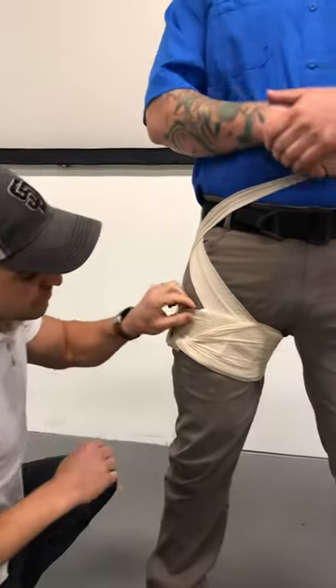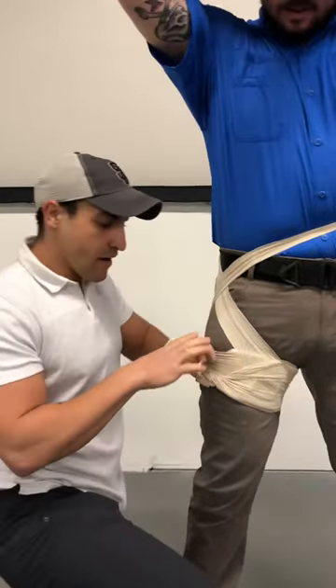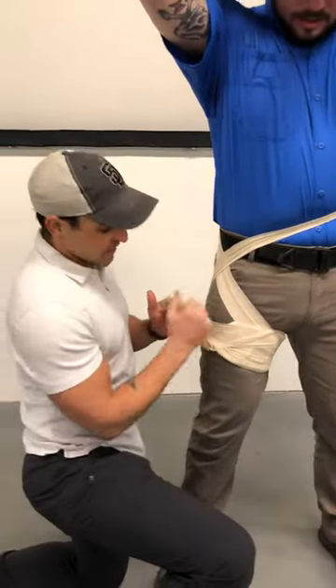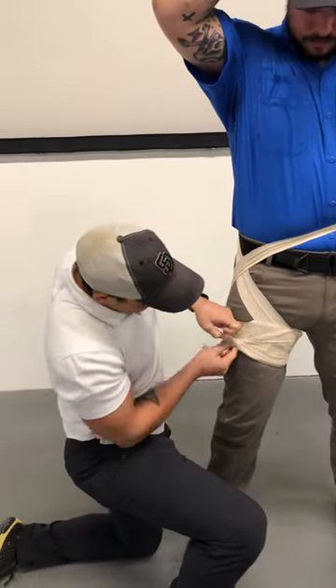A big thing with this also, especially with people with bare legs — what you might also want to do is tie in another ace wrap and just continue to wrap the actual leg more so than it already is.